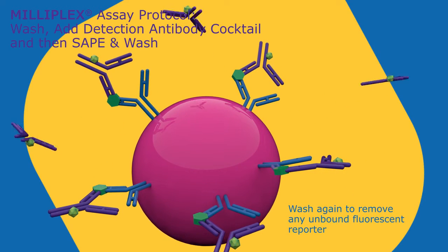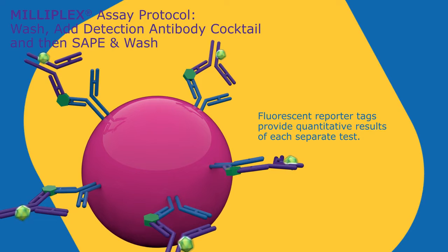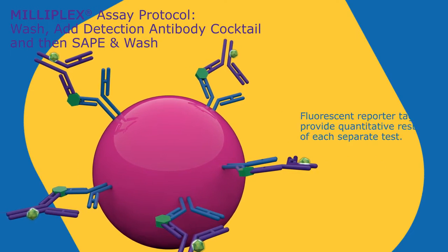Add detection antibody cocktail, then wash again to remove any unbound fluorescent reporter. A fluorescent reporter tag conveys the quantitative results for each analyte.